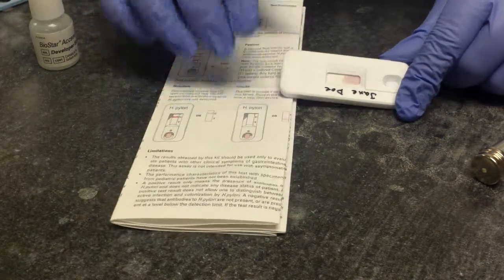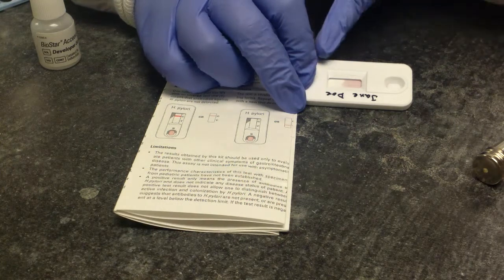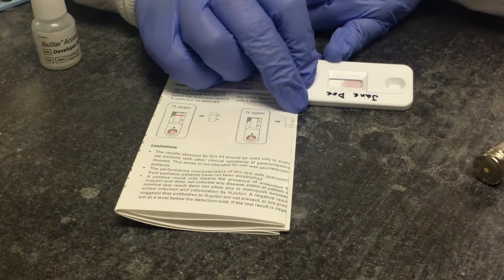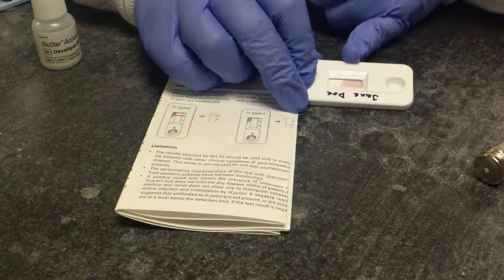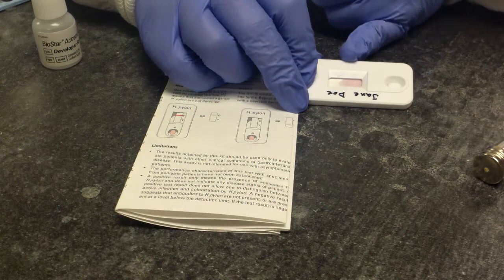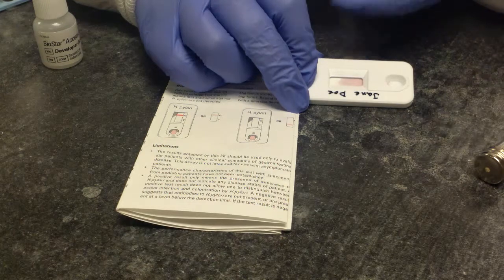It's so exciting. We're going to be looking just like all our other test kits for our control line to come up. That's going to tell us that our test is valid. We're going to look for a positive line at the test site. That would be a positive test. A lack of a line at the test site would be a negative test.